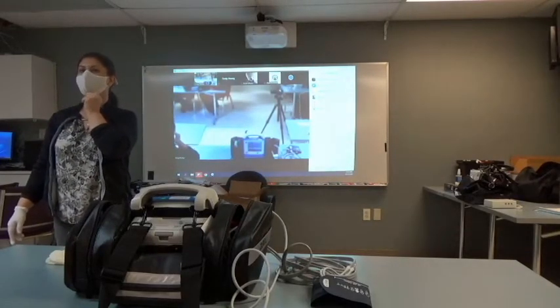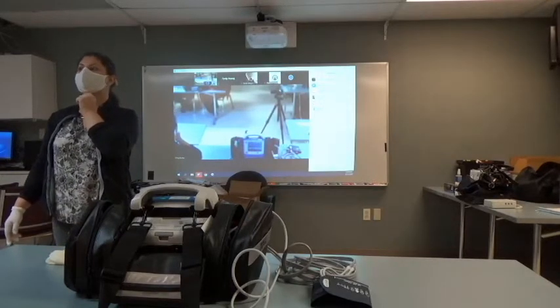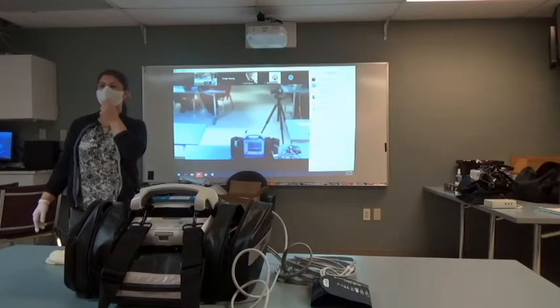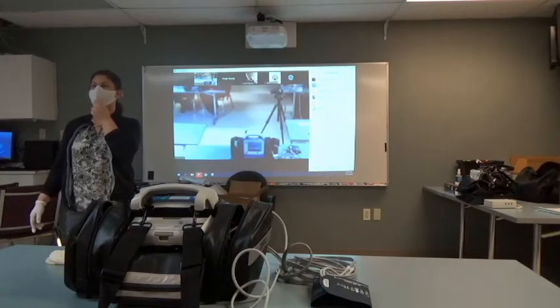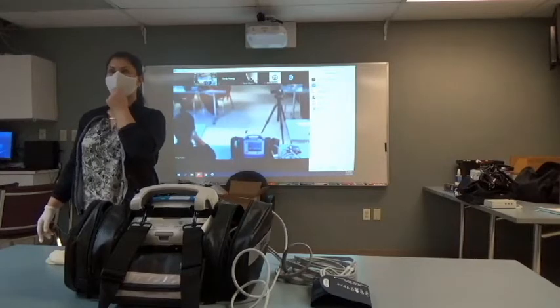Let's recap really quick. If I see a yellow light on the top of my device, what is that telling me if it's flashing? Error. What kind? Something that we can fix, something with your equipment that you can correct. How do we make it quiet? The alarm sound. The alarms. What if I get lost and I don't know how to get out of a screen? The home button. And which button is my record button? Camera button. The camera, very good.